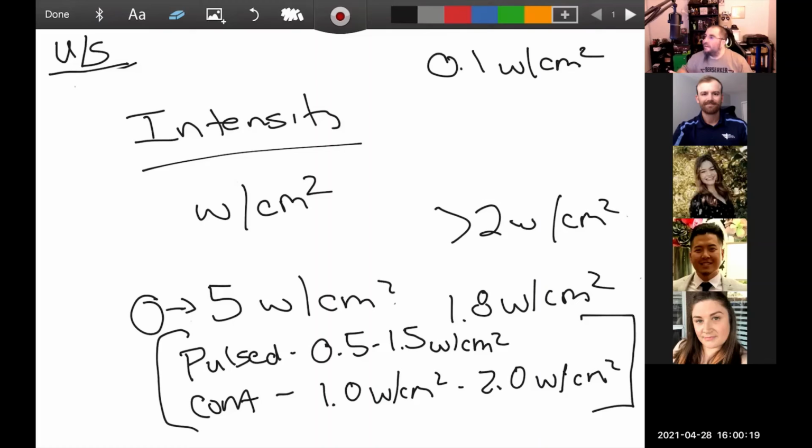Great, do it. Right? You know, you're doing continuous ultrasound at the patient's low back, and you're like, oh, I'm going to start at 0.5. Well, why are you starting at 0.5? Well, I'm going to start at 0.5 because the last time I did this, the patient didn't react well. Great, that's a valid answer.